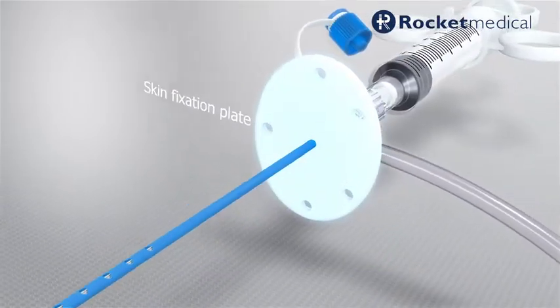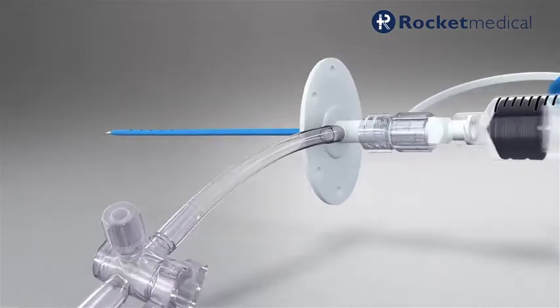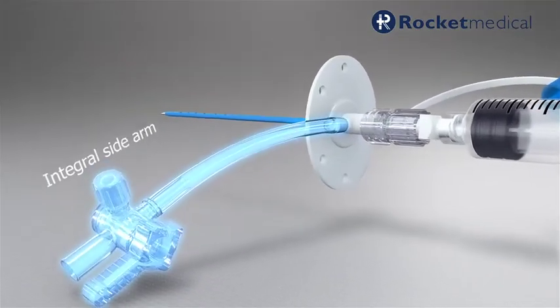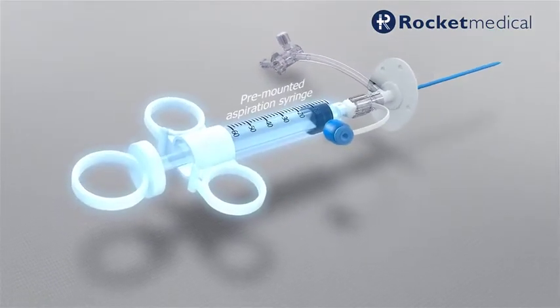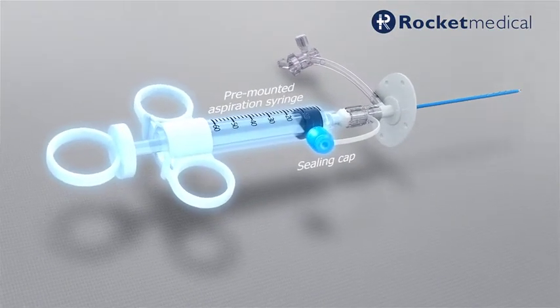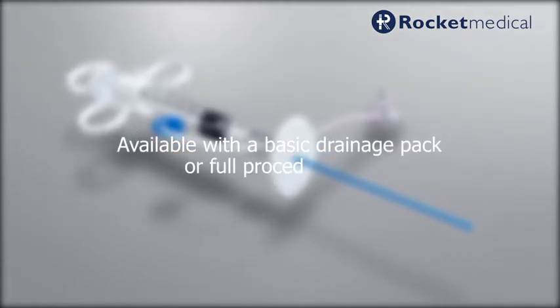The skin fixation plate secures the catheter after insertion. The catheter also features an integral sidearm with 3-way tap, a pre-mounted aspiration syringe, and a sealing cap. The catheter is available with a basic drainage pack or full procedure tray.